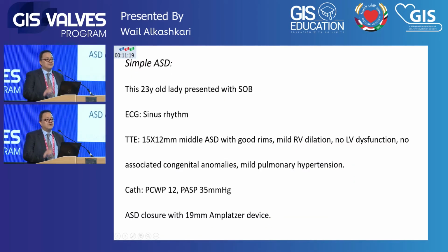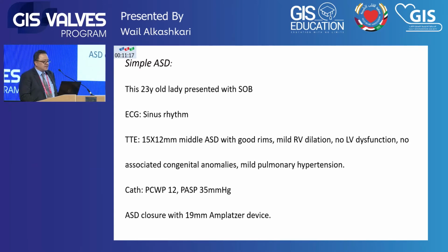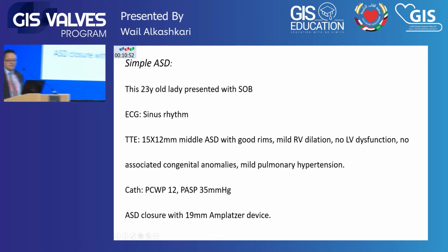So I will give you an example of a simple ASD quickly. This is a 23-year-old lady. I said 23, not 25, because of the paper from Mayo Clinic: any patient above 25 presented with ASD, mortality, even if you close surgically or percutaneously, is higher than that of similar males or females at the same age without ASD. So 15 by 12, middle ASD, good rims.